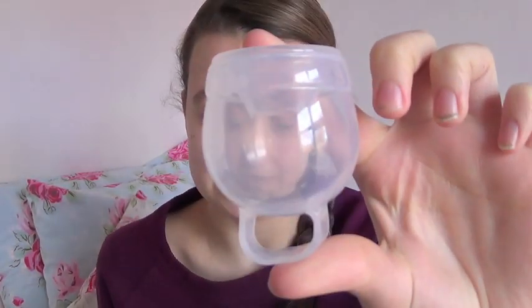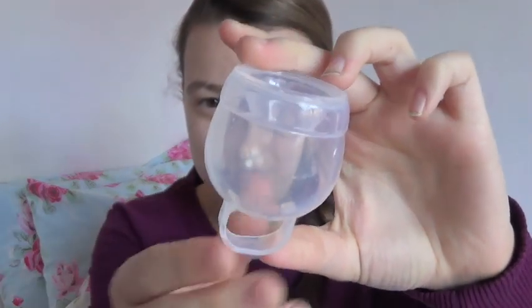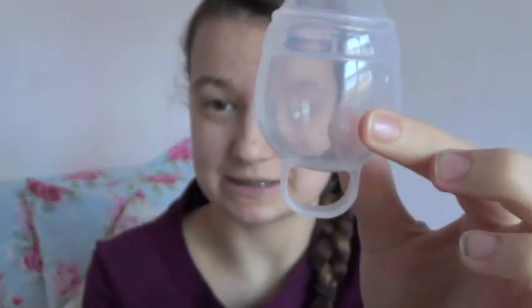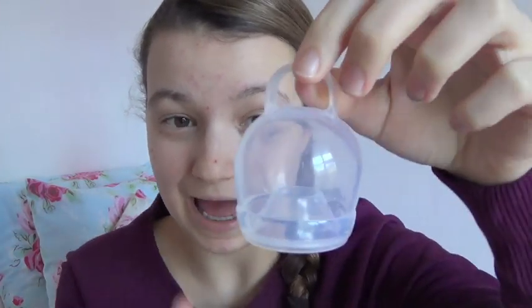This is what the FemiCycle cup looks like. You can see it's a very unique shape compared to other cups and it also has this unique rim. The rim pops out like this so that when it's been inside you and has collected your menstrual fluid, you can pour it out into the toilet. This feature is what allows the cup to be a non-spill menstrual cup — you can actually tip it upside down when it's got liquid in it and it won't leak.